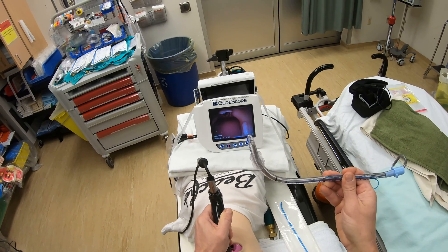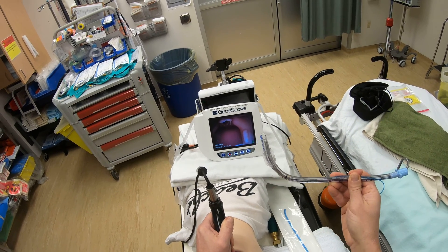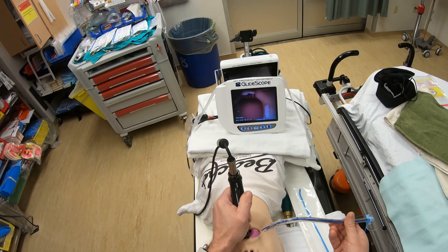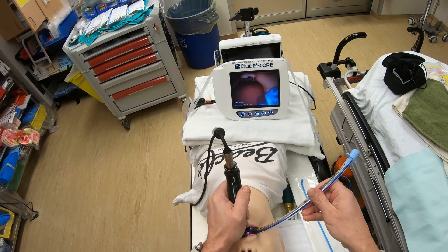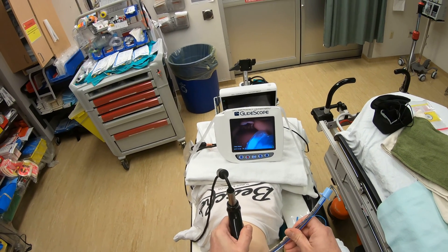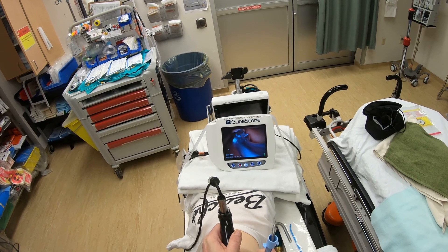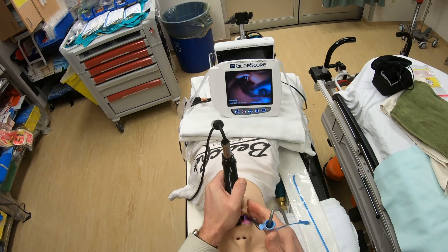If you're using an endotracheal tube, shape it with a stylet at about 60 to 70 degrees. You can use a rigid stylet, but we prefer a flexible one. Always enter from the corner of the mouth. Look in the mouth, watch your device disappear, then you'll see it on the screen approaching posteriorly. By rotating the endotracheal tube towards the midline, it comes up anteriorly — and you watch the cuff disappear.